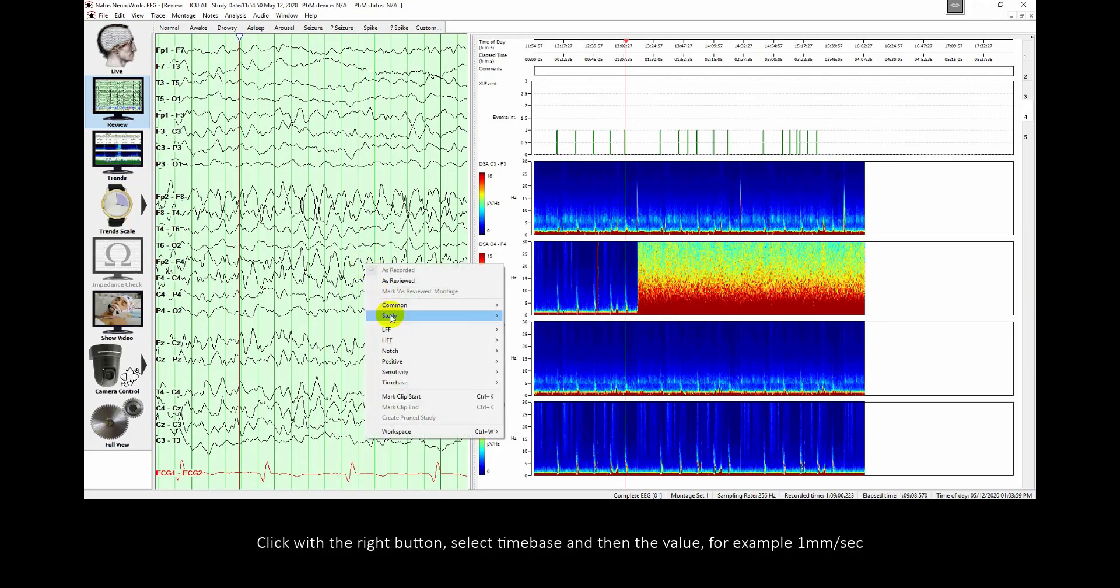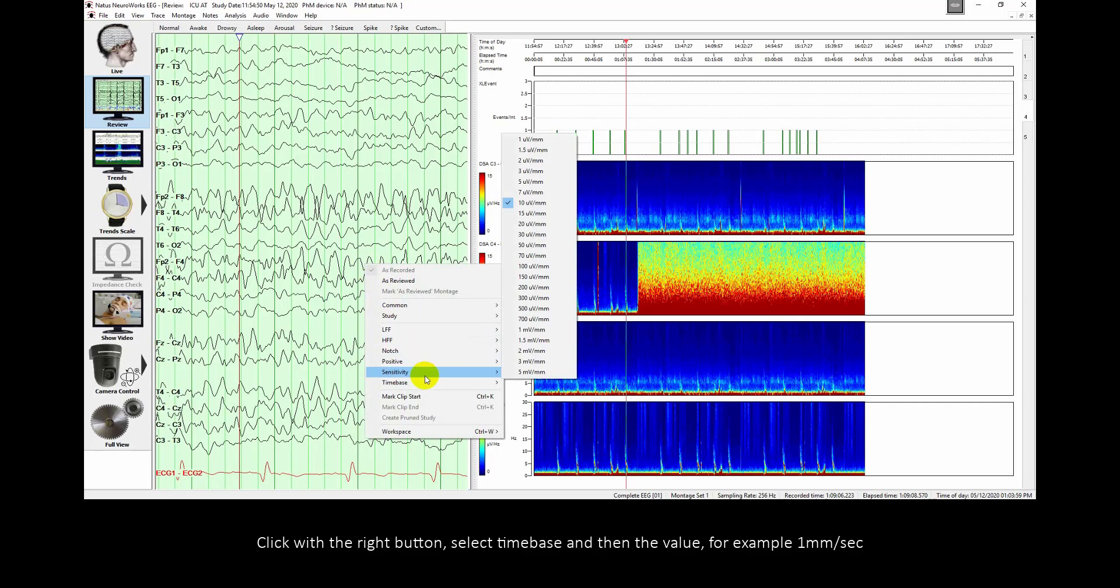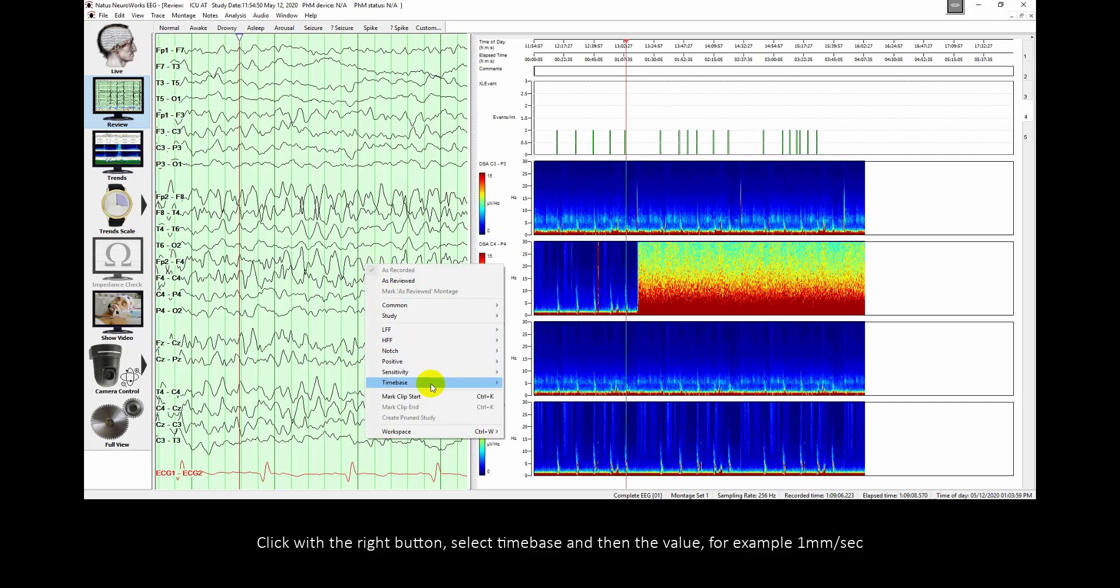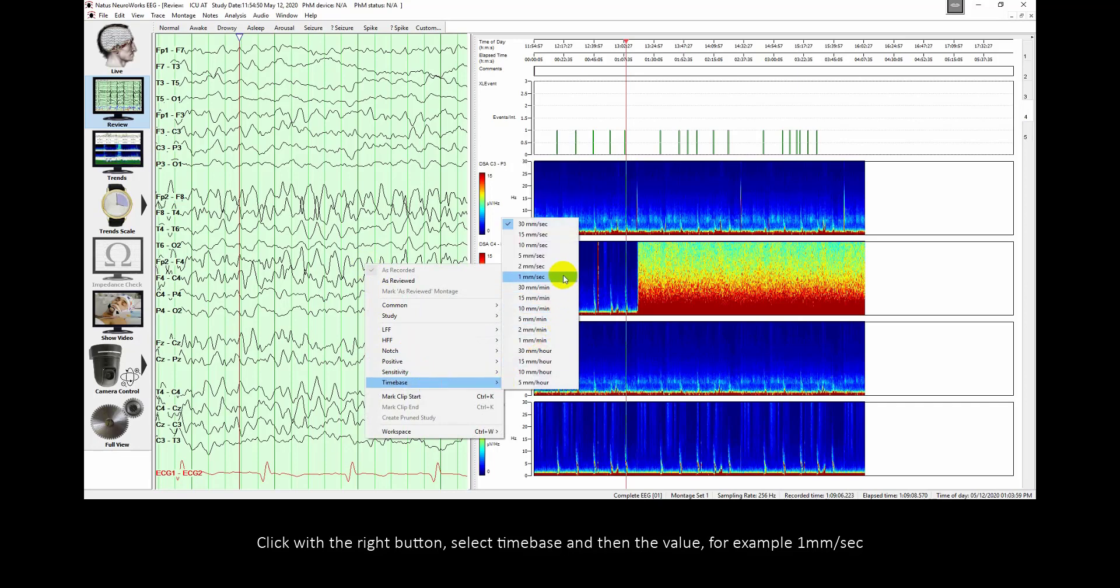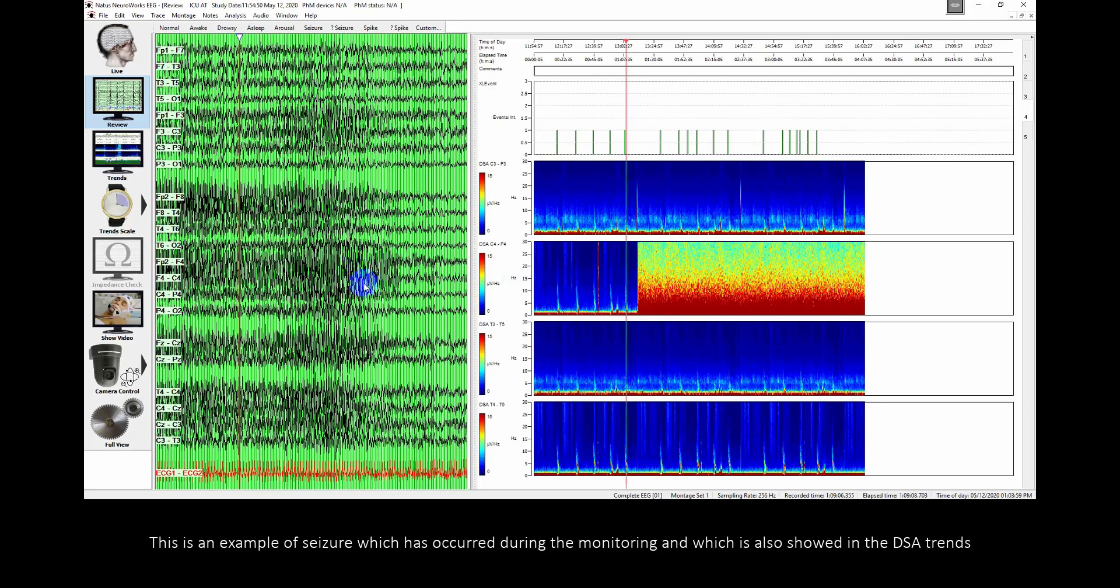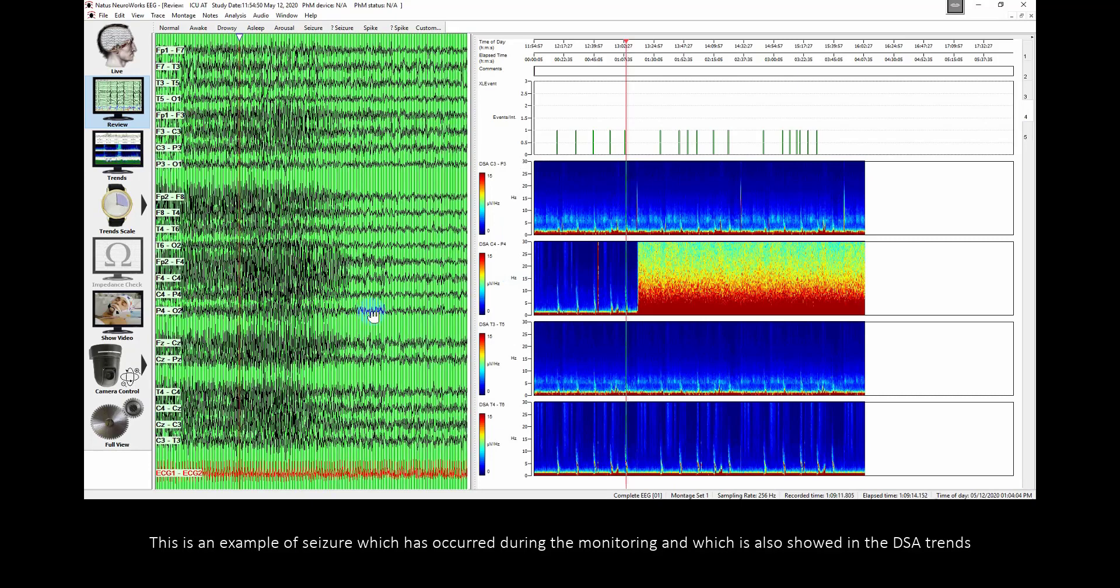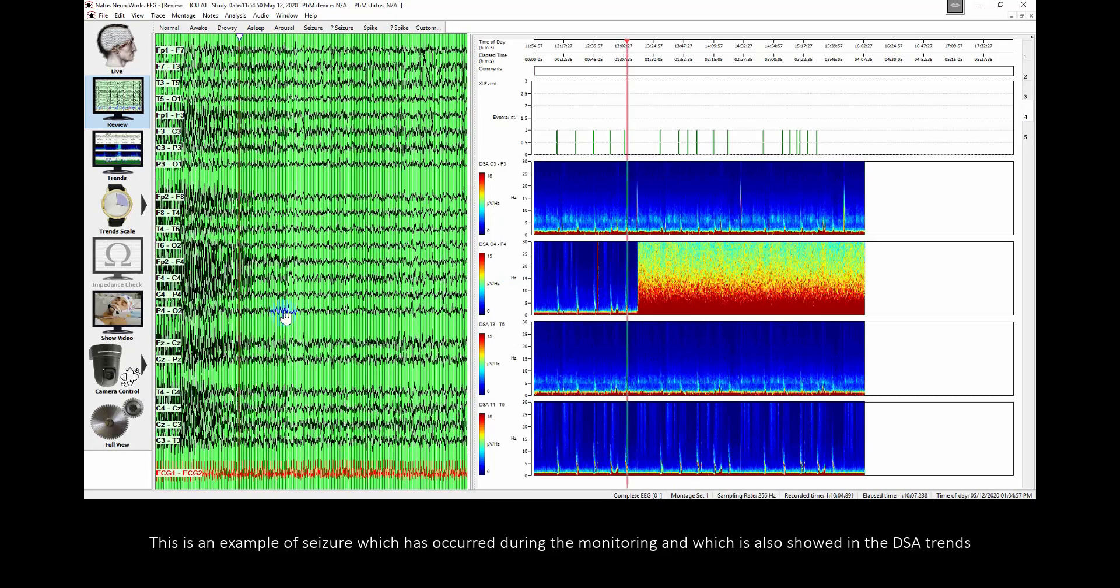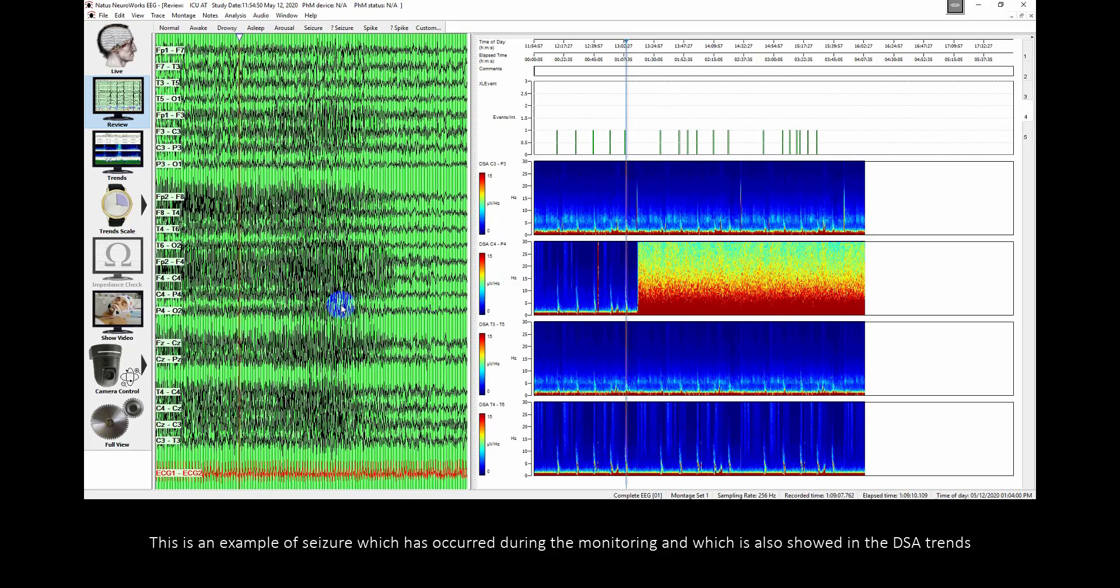Click with the right button, select time base and then the value, for example 1 mm per second. This is an example of seizure which has occurred during the monitoring and which is also shown in the DSA trends.